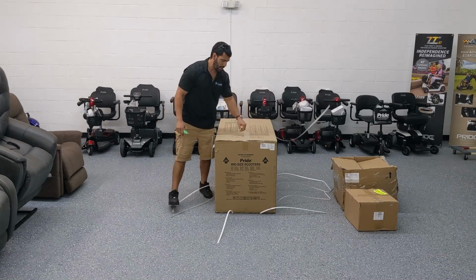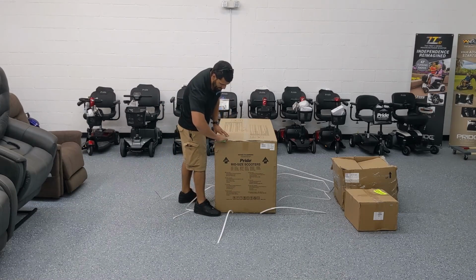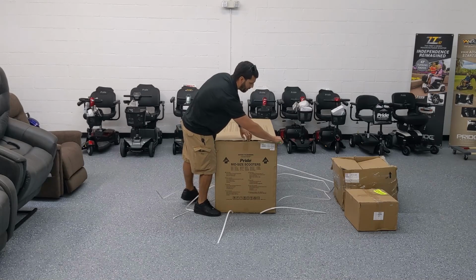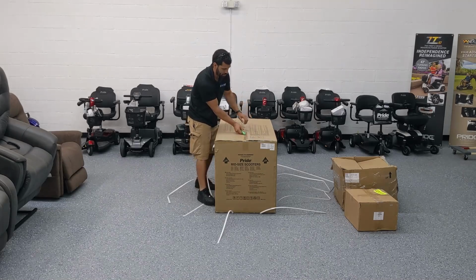Once you get the straps off, you want to do the same with the tape on the edges. Carefully cut it so that you can open the box without harming or damaging the product on the inside. I like to go in at an angle instead of straight on down.